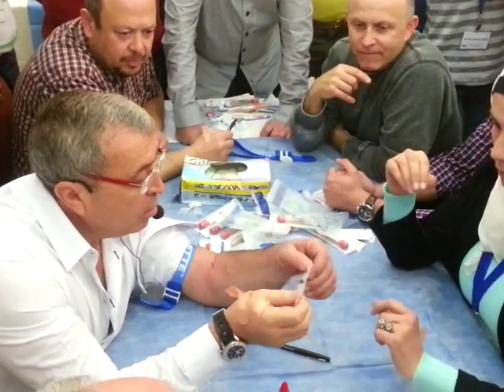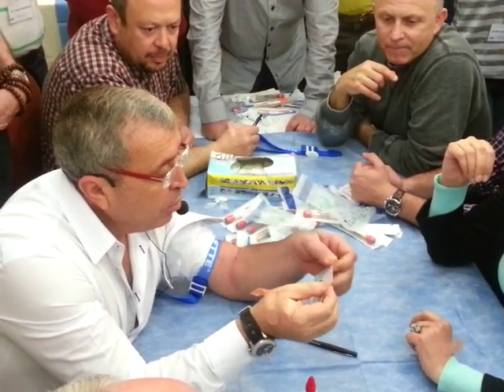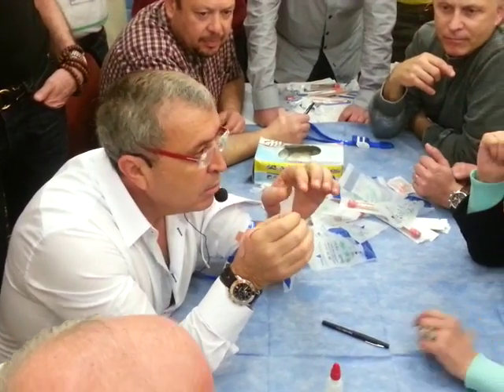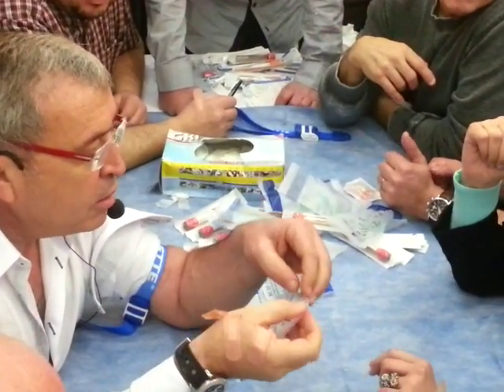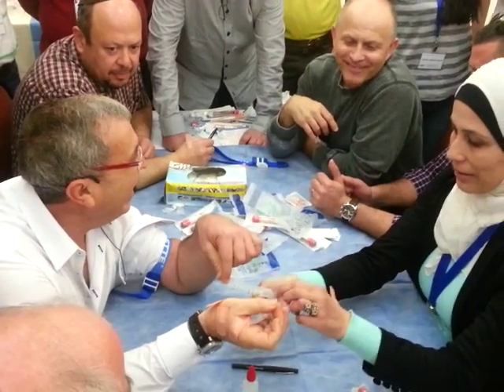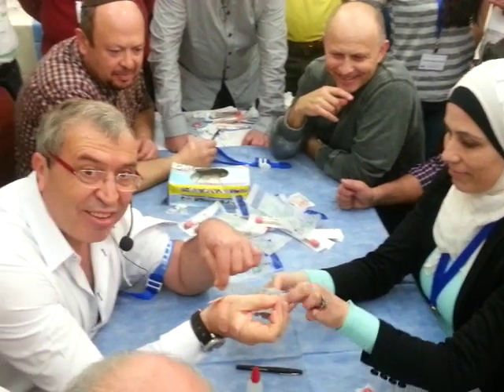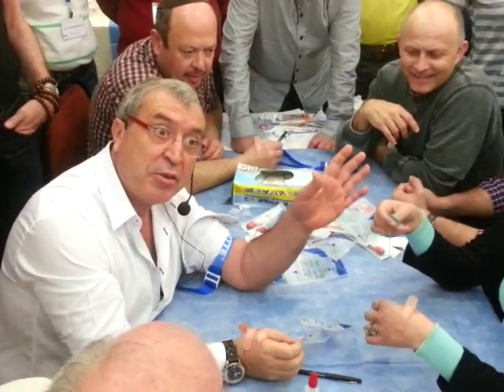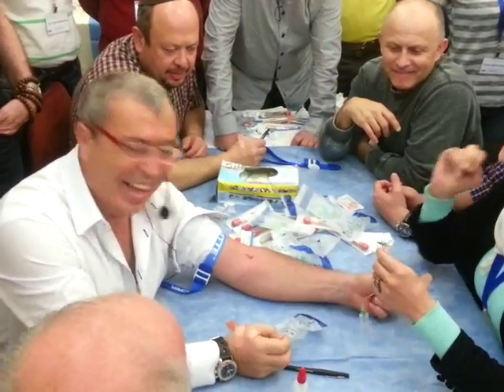We open the pocket like this, not like a dentist. Open here, we do like that. What we said yesterday — we are not in dentistry. We are not in dentistry.